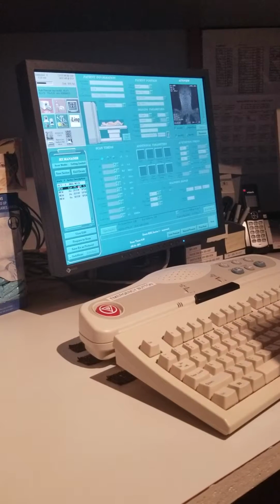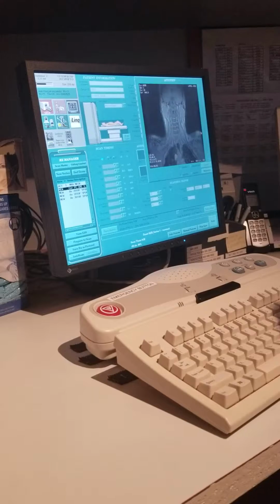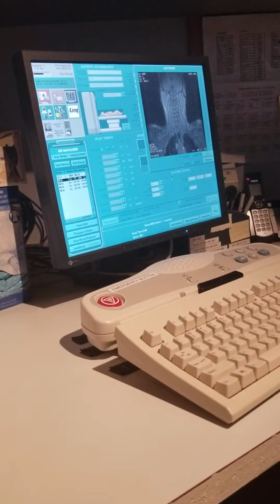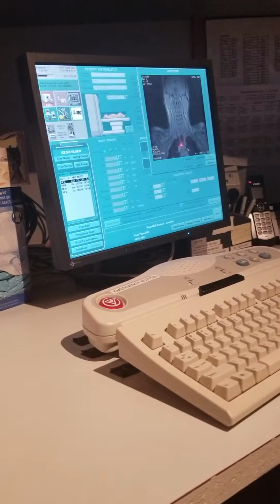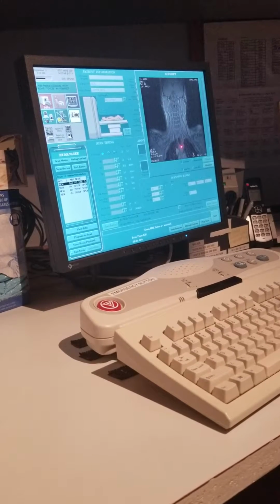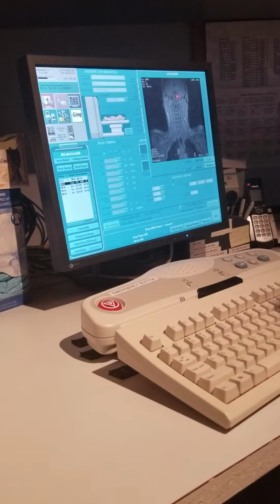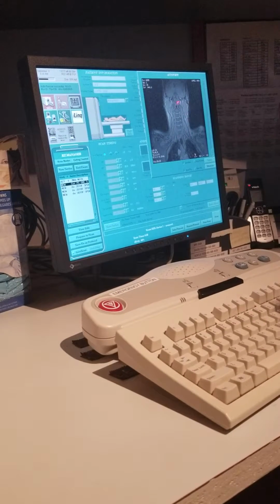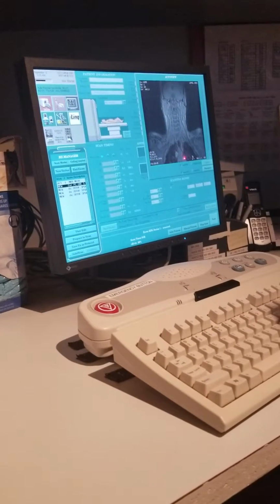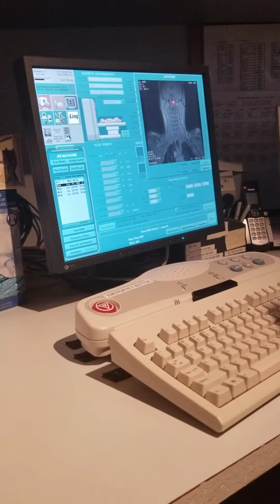You can actually see the arch there, with the vessels coming off the heart. I don't know exactly what vessels those are. When you're doing the 2D time of flight, you'll include the arch all the way up into where the intracranial starts. Extracranial is considered carotid. Intracranial is considered circle of Willis. So we'll scout and catch the 2D time of flight from the arch to the base of the skull, basically.